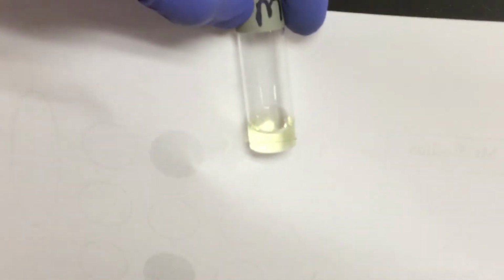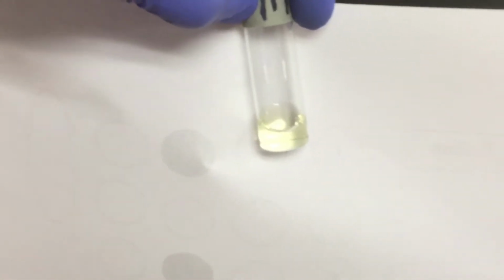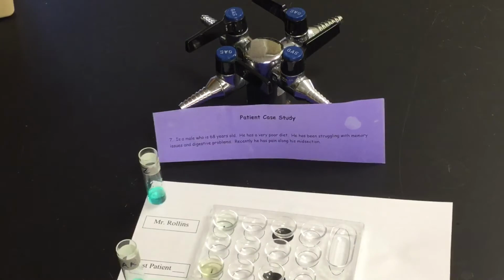So as you can see, it is very clear, so the clarity is clear on that. And it's actually almost a translucent color. It's super, super light in terms of yellow. So give me a color that will correlate with that particular sample for patient number 7.